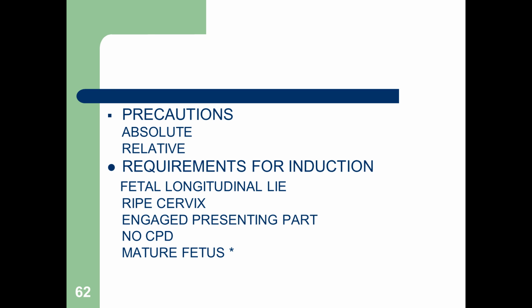Either it's because it's post dates, or because the mom's got a problem, or the baby's looking bad. Okay, so those are those indications, and we have to pay attention to what's going on with the patient.